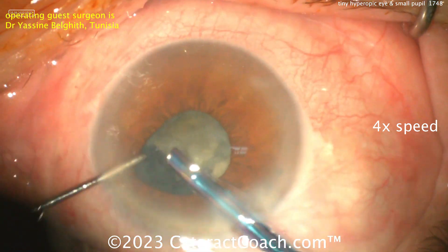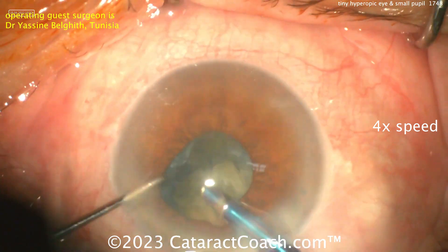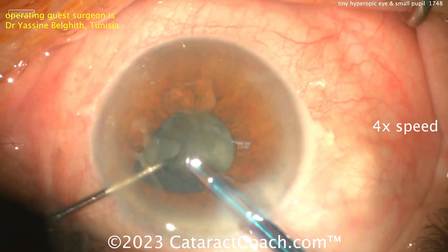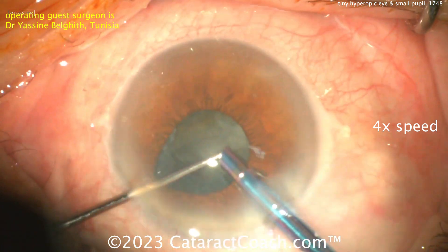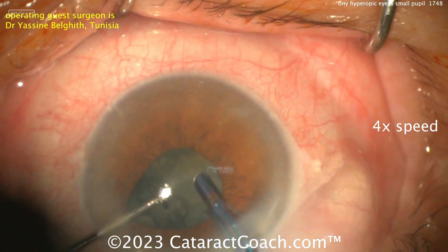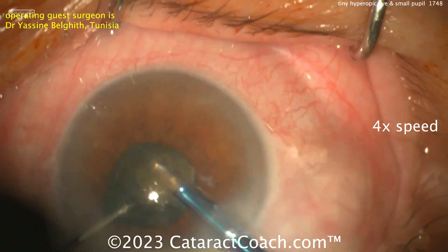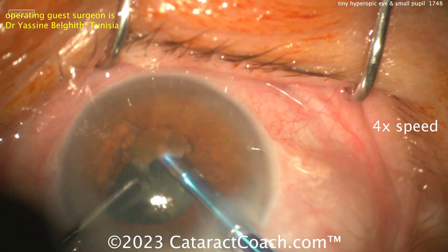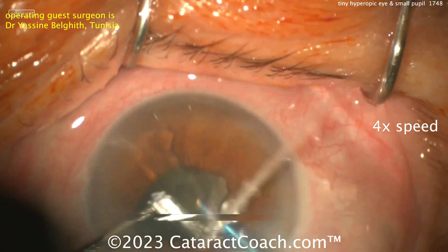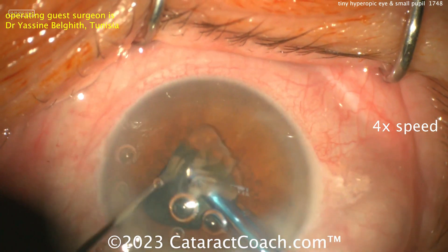This may be three or four times speed — video is sped up, but I just want to show the challenges of this case. In a patient like this, you're probably going to put a monofocal lens, especially in this amblyopic eye. Our best goal is to aim for a post-op refraction of close to plano. Depending on the degree of anisometropia, you could have a relatively dense amblyopia.